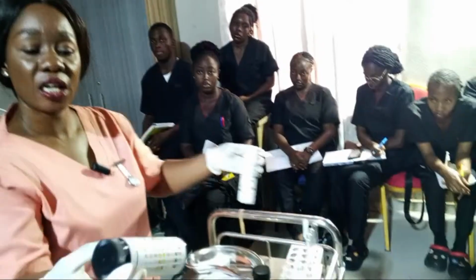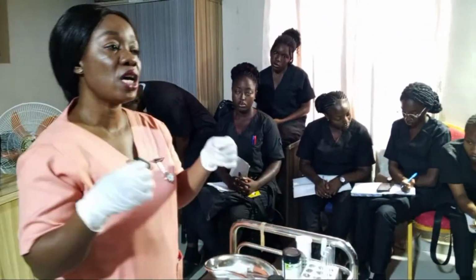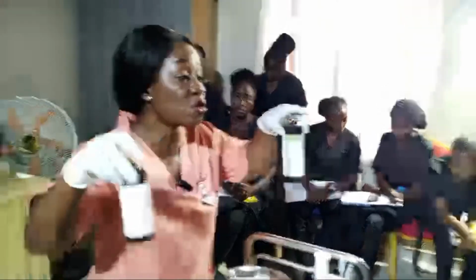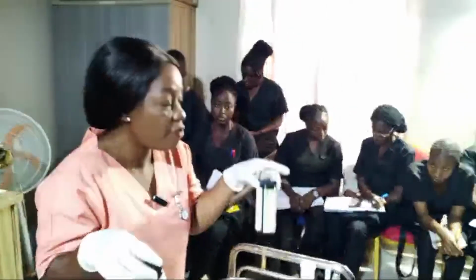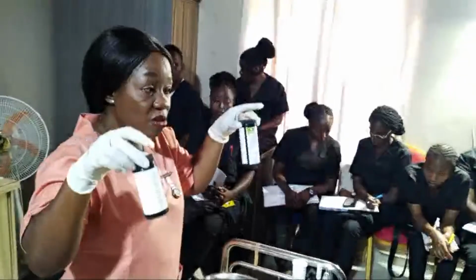So you can use different companies, like this one is another company, this one is another company, and you should be able to follow the instruction of the manufacturer of each product that you are using. Follow the instruction of each manufacturer, right?